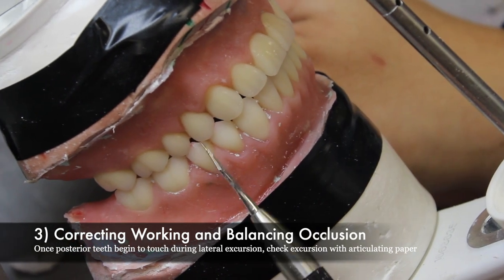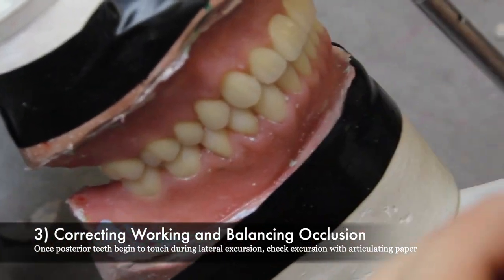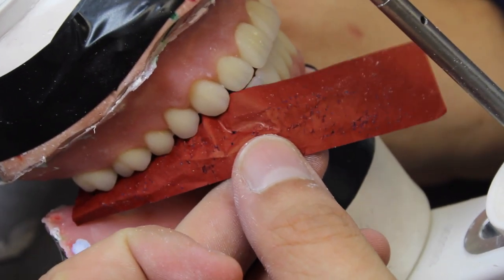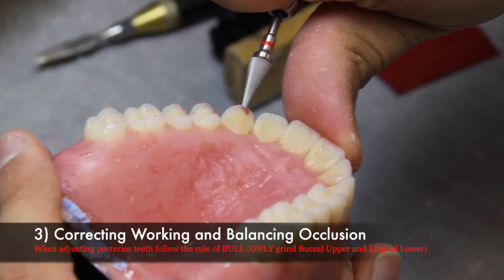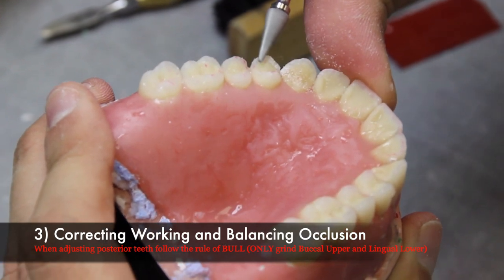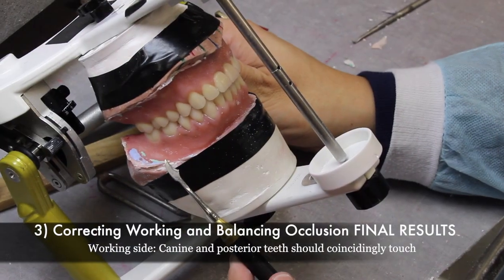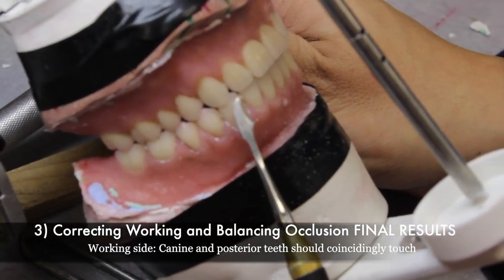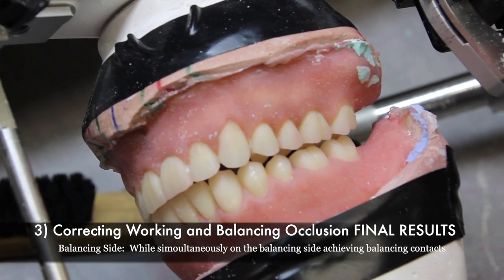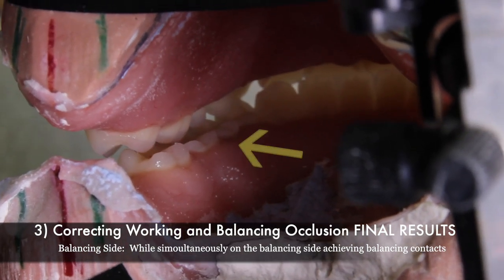Once the posterior teeth begin to touch during the lateral excursion, check the excursions with articulating paper again. When correcting the working side occlusion, the goal is to have the canine simultaneously touch with the posterior teeth during lateral excursions. When correcting posterior working side interferences, you will follow the rule of BULL, which means you will only grind on the buccal surfaces of the upper and the lingual surfaces of the lower. If done correctly, on the working side the canine and posterior teeth should touch coincidentally together, while on the balancing side there should also be a contact simultaneously. Here is a lingual view of the lingual cusps riding the buccal inclines of the lower mandibular teeth.